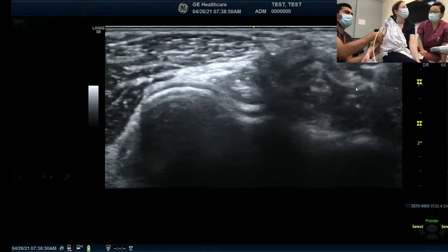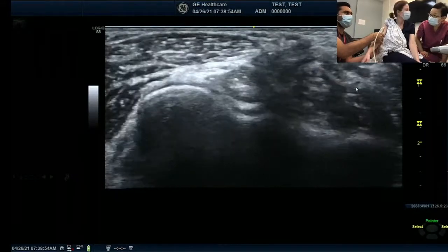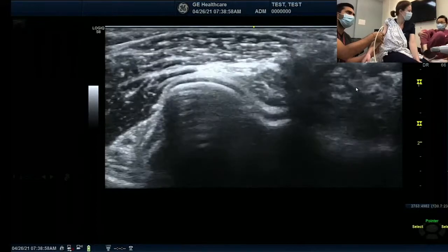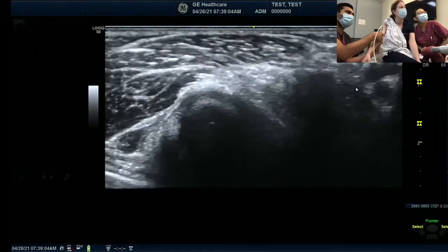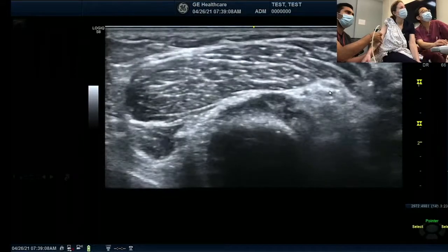Okay, so actually, as I showed yesterday, my median nerve is in a different place. It's not on the medial side. I felt like I got confused. I scanned a million times, but it was the median nerve. Maybe that's why you're so good with injections. Maybe it helps. Okay, now we are following here.